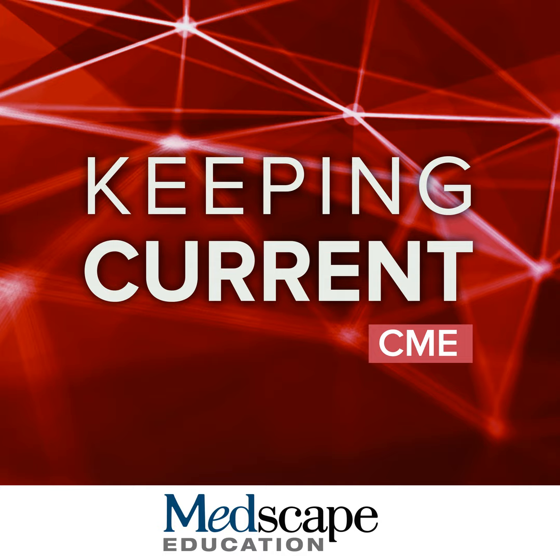DTI has also been used abundantly in the research arena to try to better understand mild traumatic brain injury. And again, it comes with limitations for a variety of reasons, and the results that were obtained in those research studies sometimes contradict each other. But typically, again, in the research arena, when DTI is used, it's for groups of patients, where you take 100 patients with traumatic brain injury and 100 patients without traumatic brain injury, and you compare those groups.